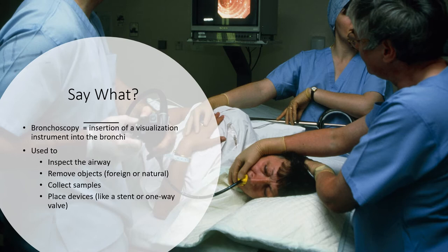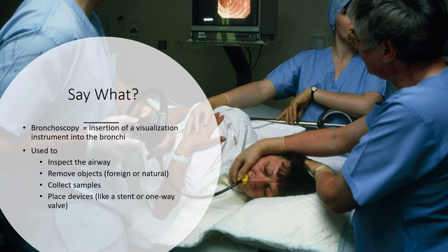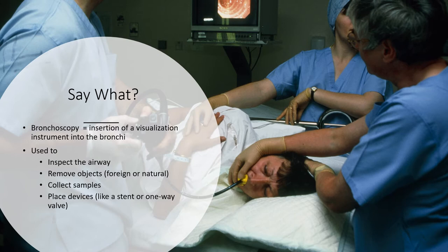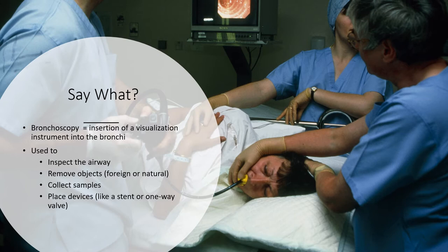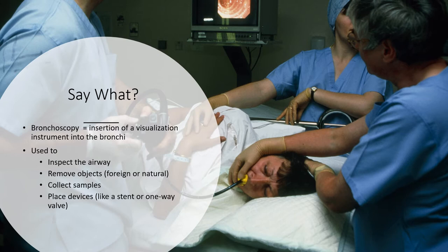We can also do cytology, where we get a brush and brush against something in the airway. We wire-snip the edge of that brush off into sterile saline, label it where we got it from — like right lower lobe — and send it to the lab for cytology. Or if something is protruding into the airway and we want a tissue sample for histology, we grab it with forceps. We take that little sample from the forceps, pick it out, and put it in formalin. This is very important — tissue samples go into formalin. Then it's taken to the lab, labeled with wherever you got it.